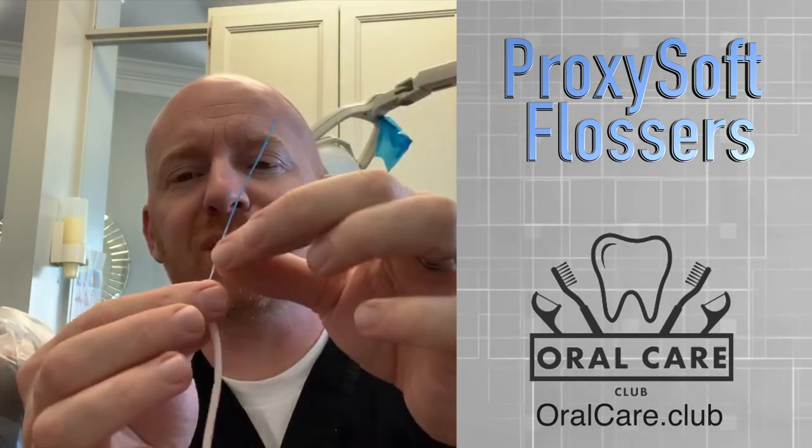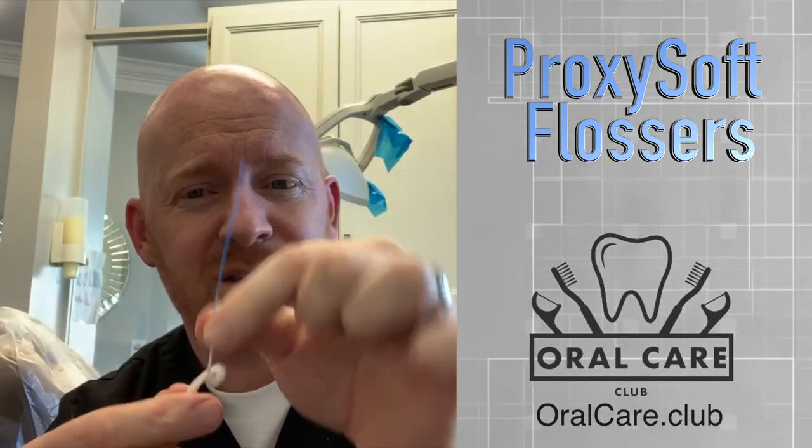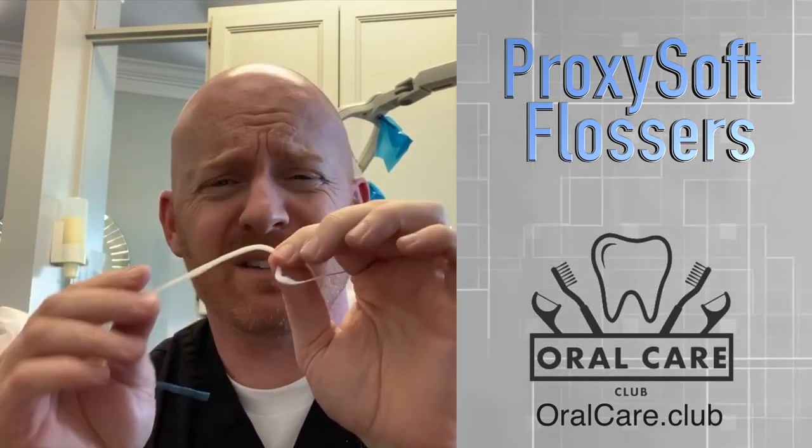In between the teeth, you can feed it through those big spaces and pull it back and forth. There are lots of different ways to do this. But Proxisoft has done an amazing job of attaching both something that can clean and something that can feed underneath the gums. This is a lot softer than some of those brushes that you have to put in underneath. You feed it with the hard end, pull it all the way through, and this is kind of a fabric puffy material that's really gentle to the gums but does a phenomenal job cleaning. And that's why I really like this product.